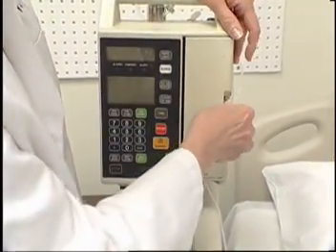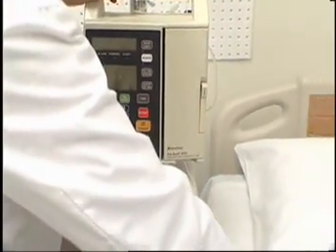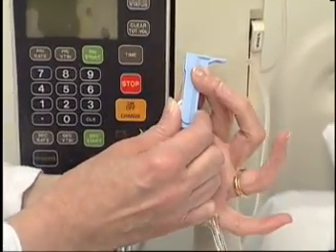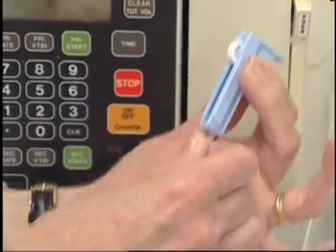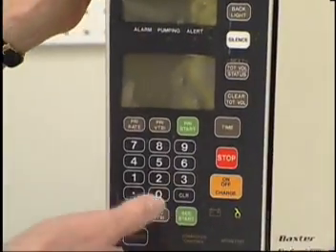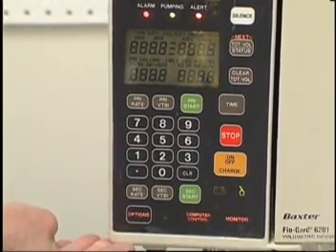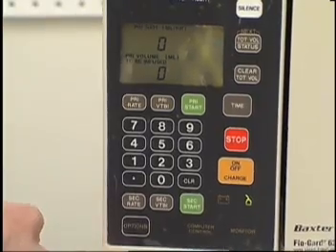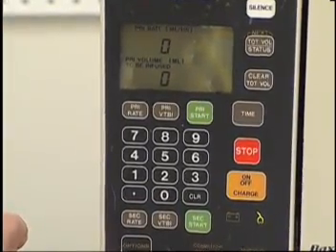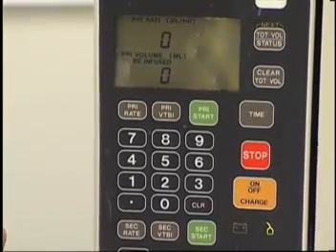Close and latch device door. Open regulating clamp on administration set. Turn device on. Set parameters for operation. Again, following manufacturer's instructions or machine's setup prompts.